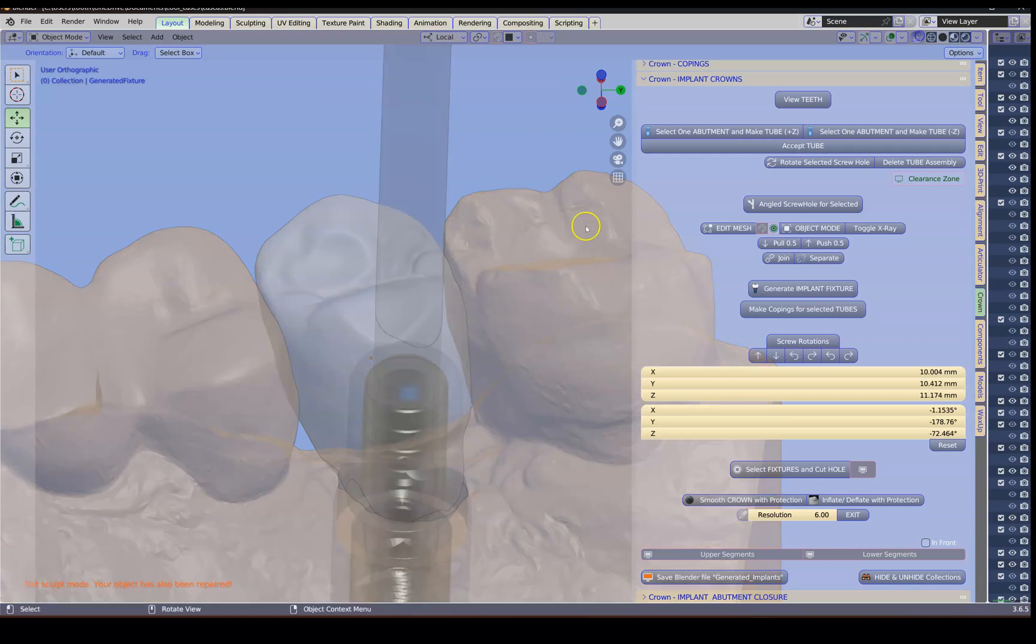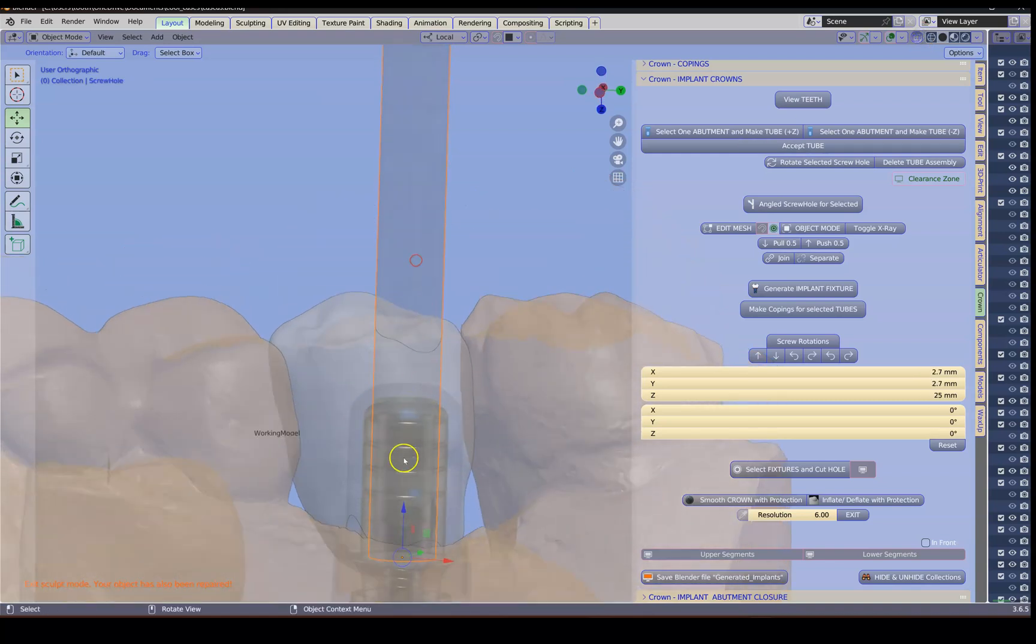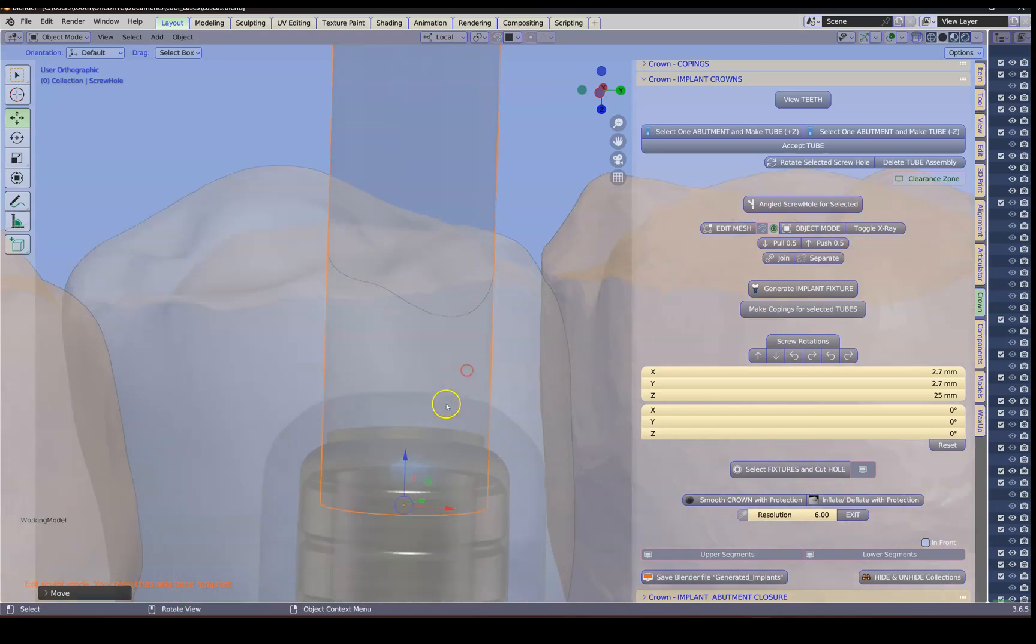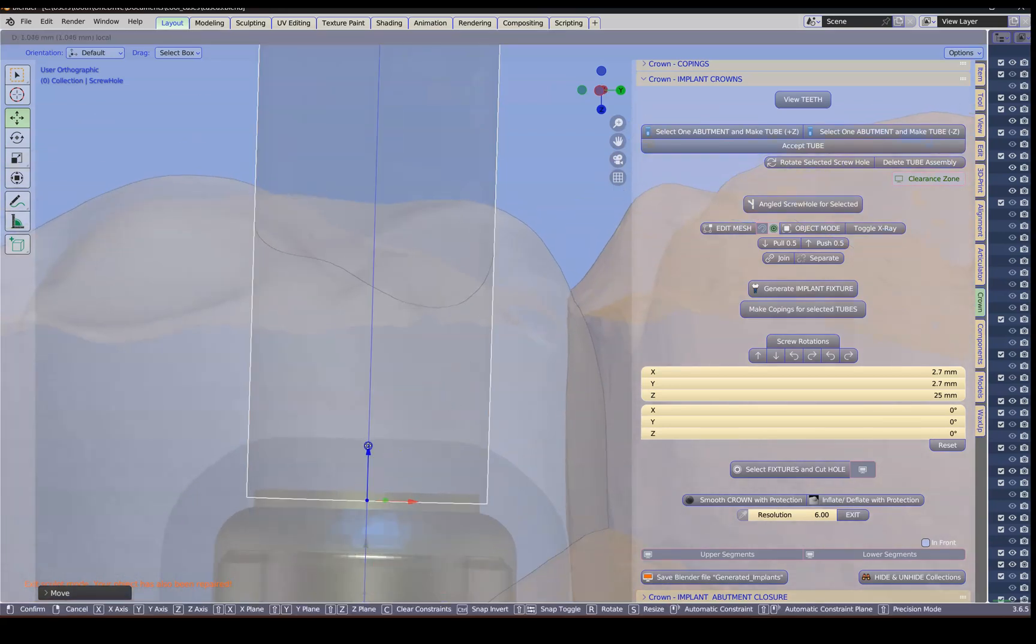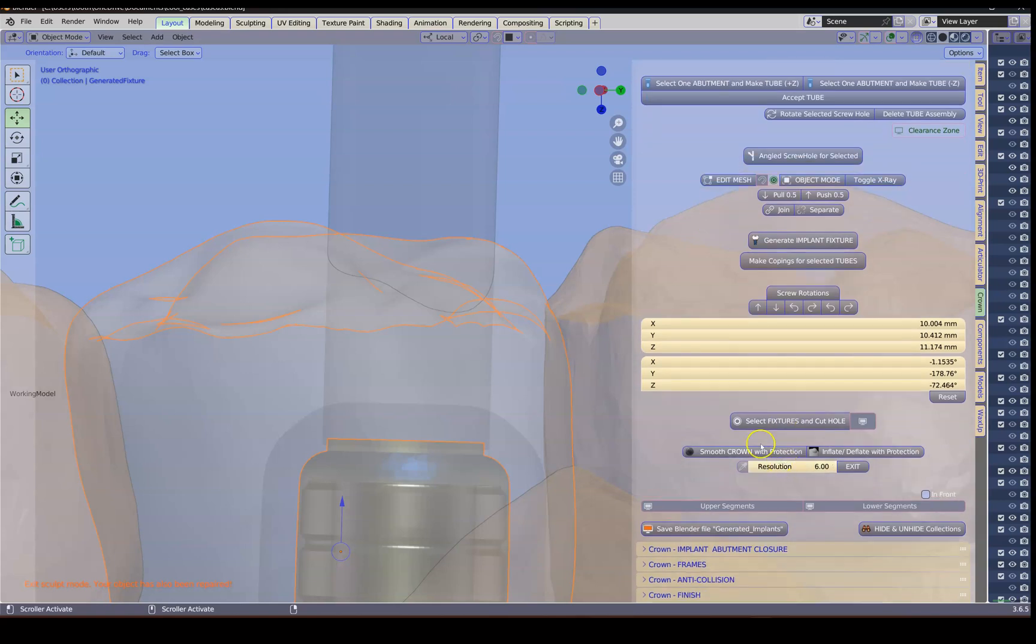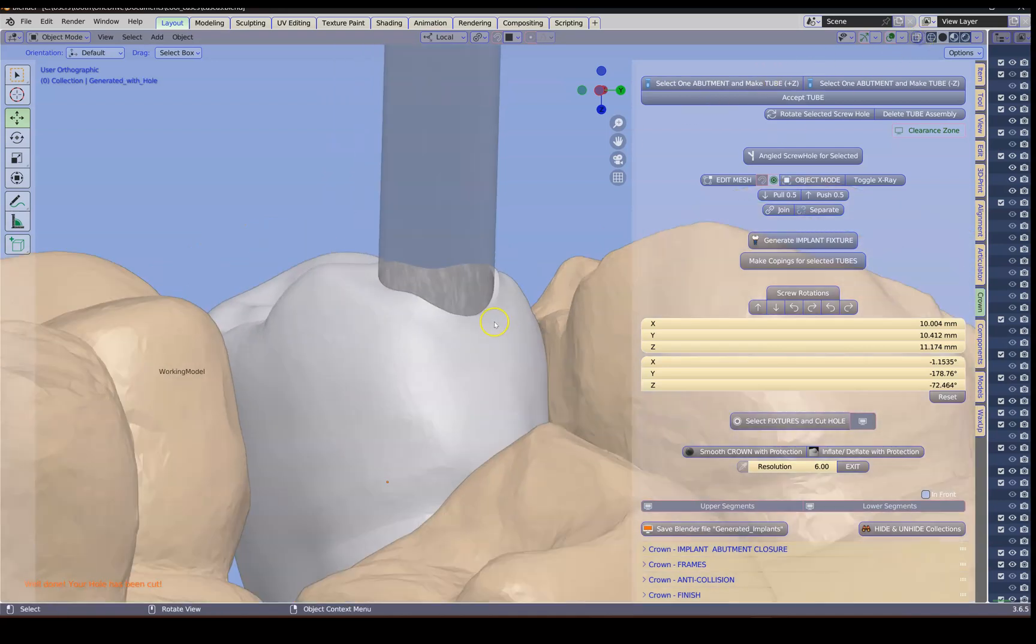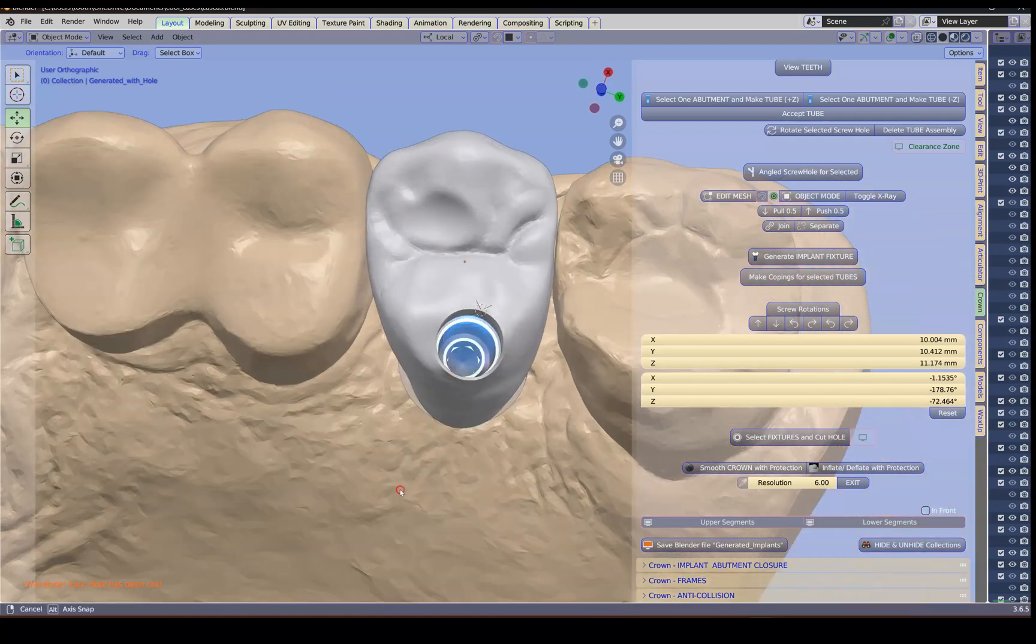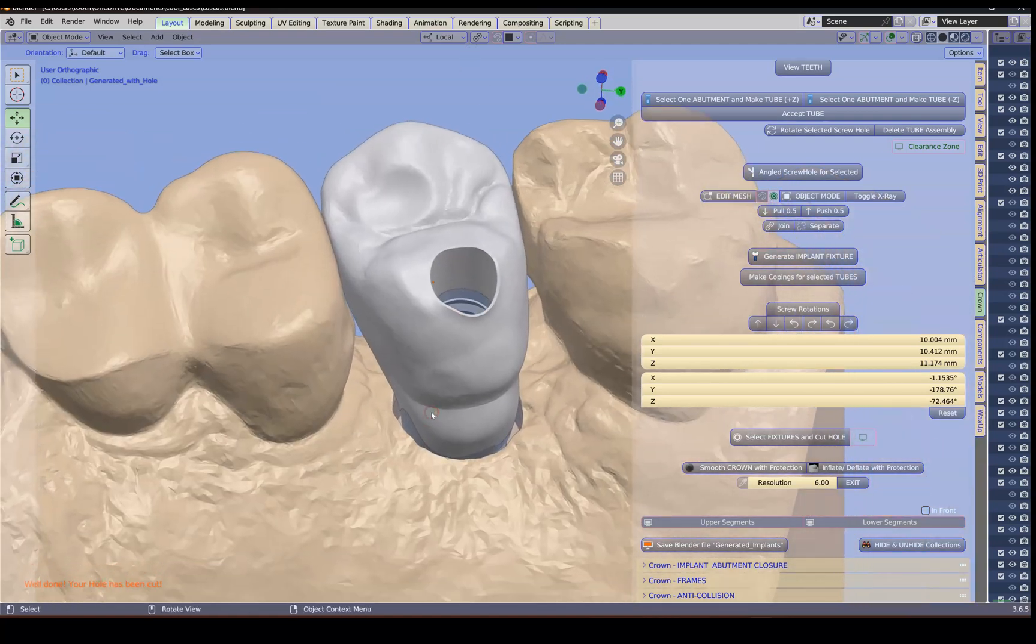Now we're going to make the hole going through it. In transparent mode, select your cutter. Bring the cutter up a bit. Select your tooth and select fixture. And cut the hole. And this is now what it looks like. We are almost finished with this implant crown. But we still want to do the contacts.